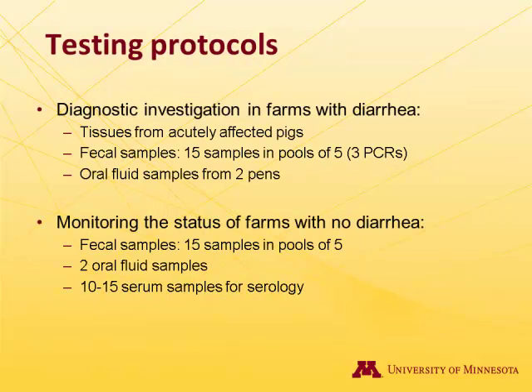Now, what are the testing protocols that we're using? We're learning as we go on this, but when I say testing protocols, I mean what kind of pigs do we select, how many samples, what kind of samples. We have all these options, right? So it's going to depend really on what we want to do and what kind of case we have in front of us. And it's hard to put together very specific guidelines, but one of the groups that the National Pork Board helped put together on PED biocontainment came up with recommendations for what kind of samples and how many to take, and this group includes diagnosticians like Dr. Madsen and Dr.